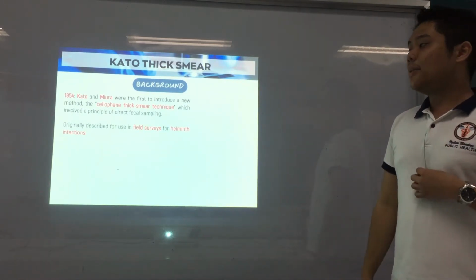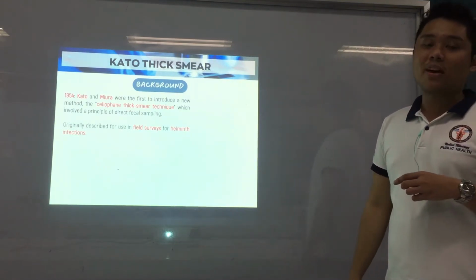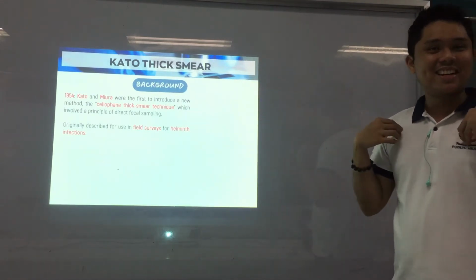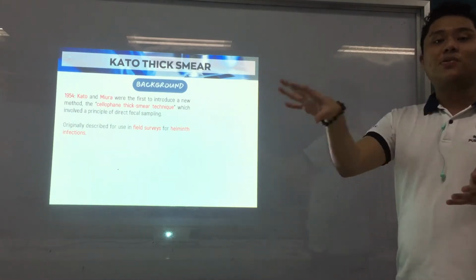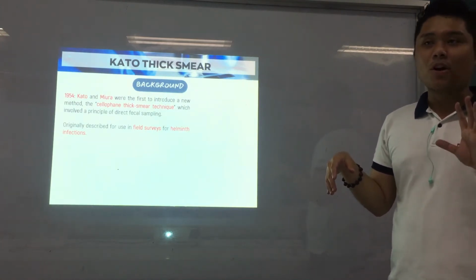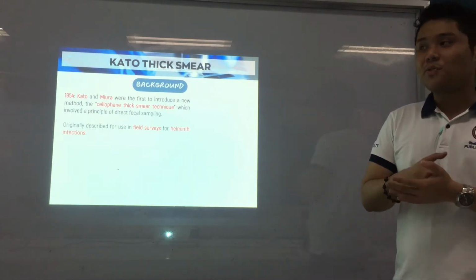It was originally used for field surveys for helminth infections. When you say field surveys, it means mass testing, mass survey of helminth infections in a large group of the population, like communities, usually for research purposes.